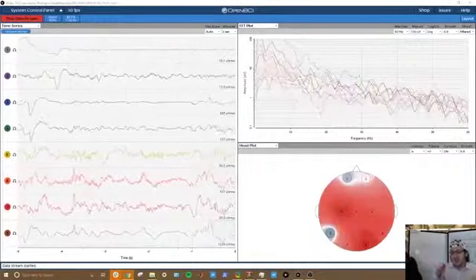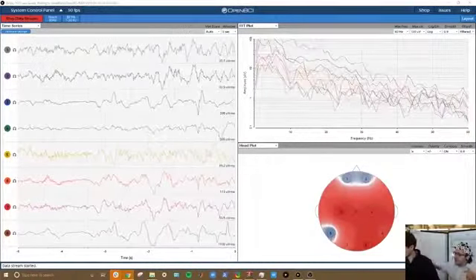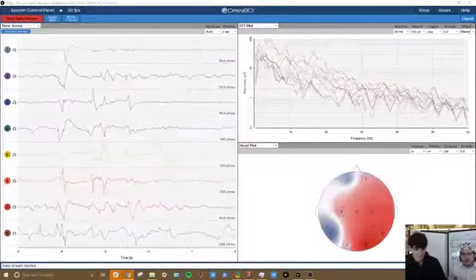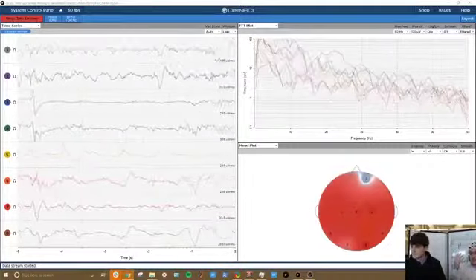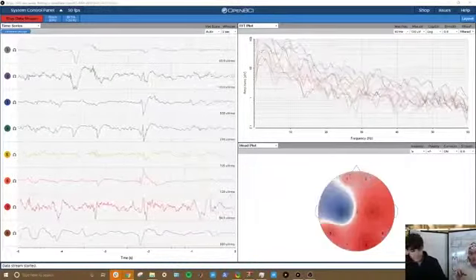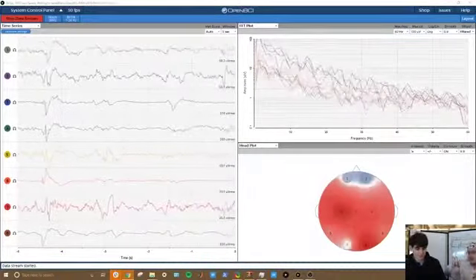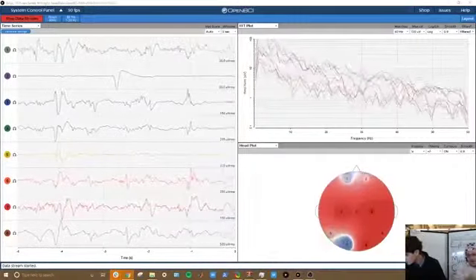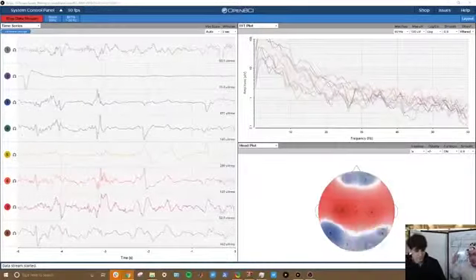You can have it send data over the internet to my other computer. I can have it send data from another device. I could create a simulation and have it set up a stream. I could take streams of EEG into it, generate a new stream after reading the EEG, classify it, and then create a classifier stream. I can create whatever stream I want and stream it to anywhere I want. That makes LSL super awesome.